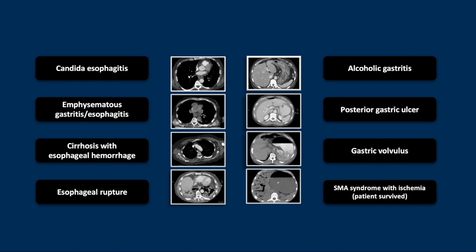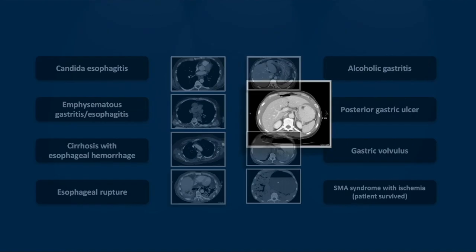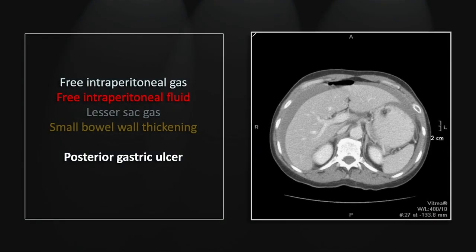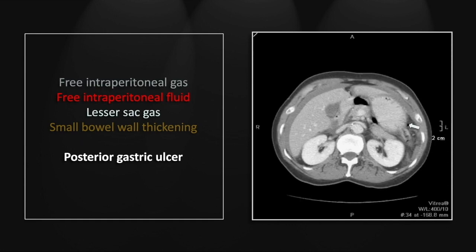Our next case is a perforated posterior gastric ulcer — a set of findings very worth knowing. There is intraperitoneal gas and intraperitoneal fluid. But on a lower cut, you can see foci of intraperitoneal gas and fluid, and in addition, small regions of lesser sac gas. That is characteristic of a posterior gastric perforation and in fact is highly specific.